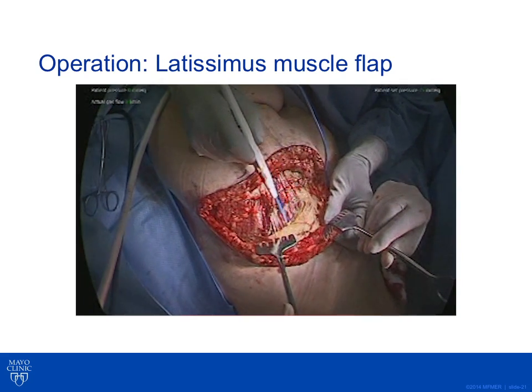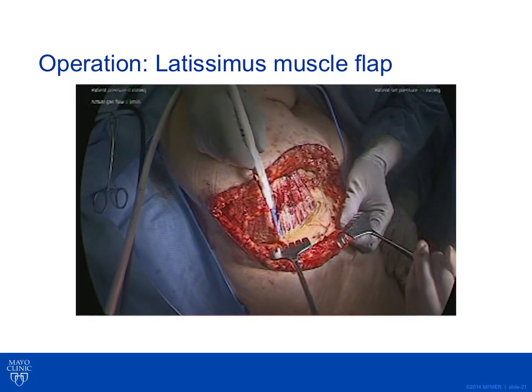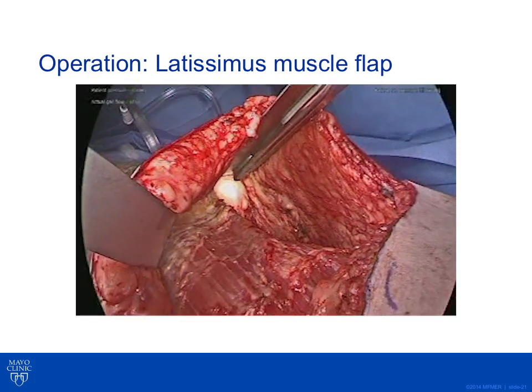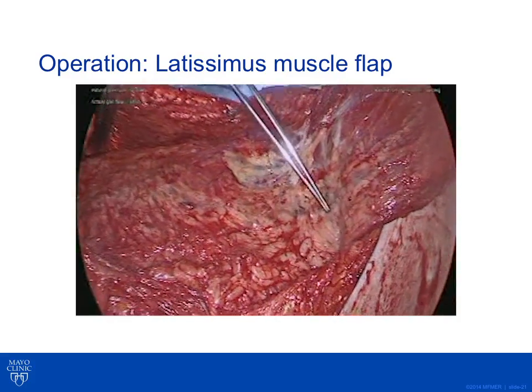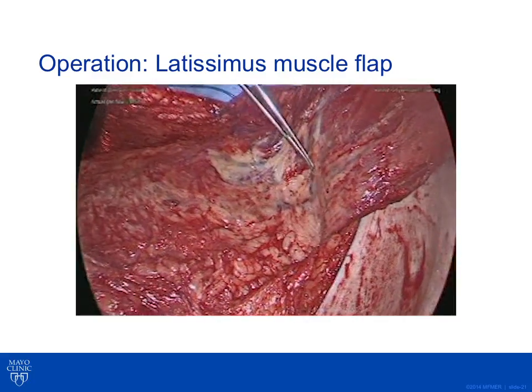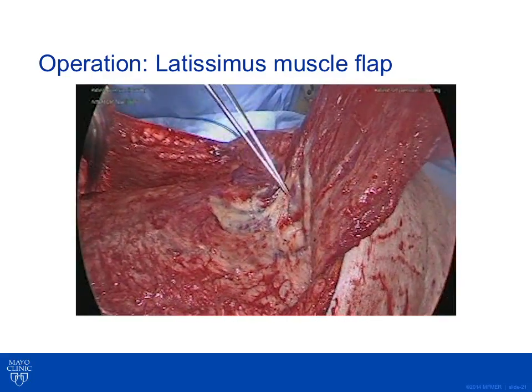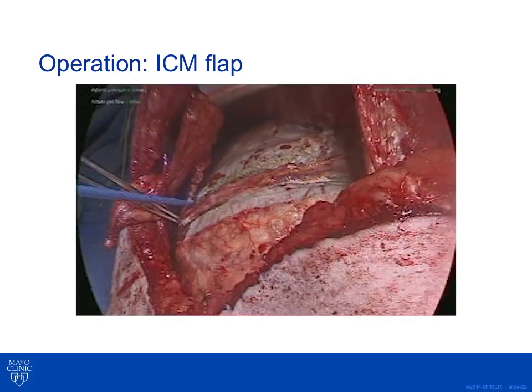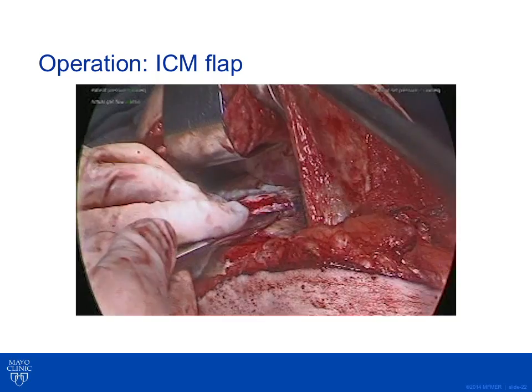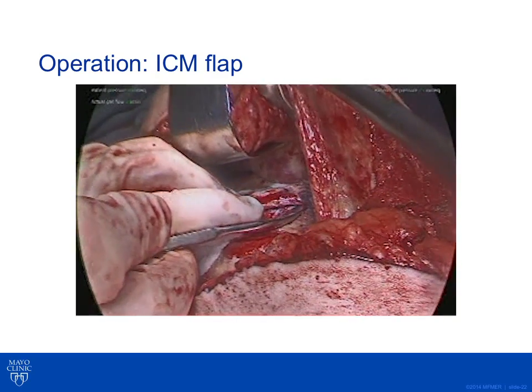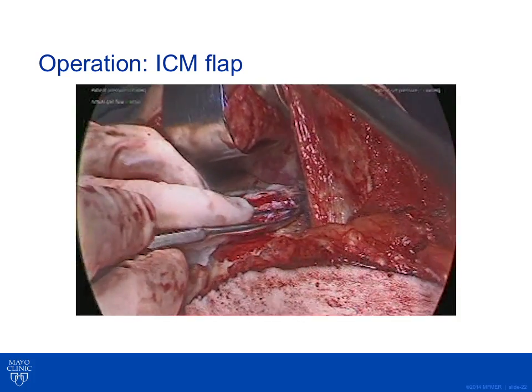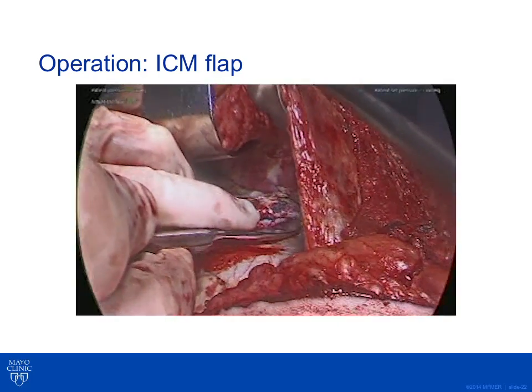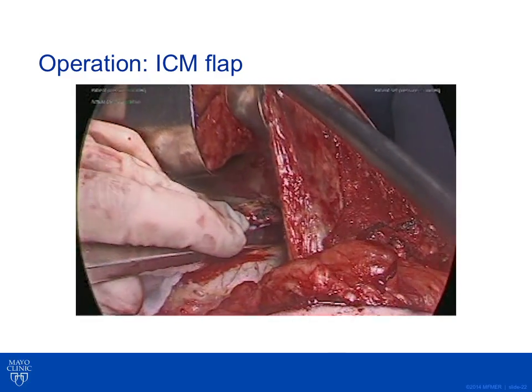A right posterolateral thoracotomy approach was utilized during surgery. The operation began with dissection of a latissimus muscle flap using bovie electrocautery to dissect out the entire latissimus muscle, keeping it based off a superior anterior pedicle, with the vascular blood supply clearly identified. We then performed an intercostal muscle flap harvest, carefully using a Madsen periosteal rib elevator to separate the nerve, artery, and vein from the undersurface of the rib using a scraping maneuver, then used bovie electrocautery to truncate the muscle.